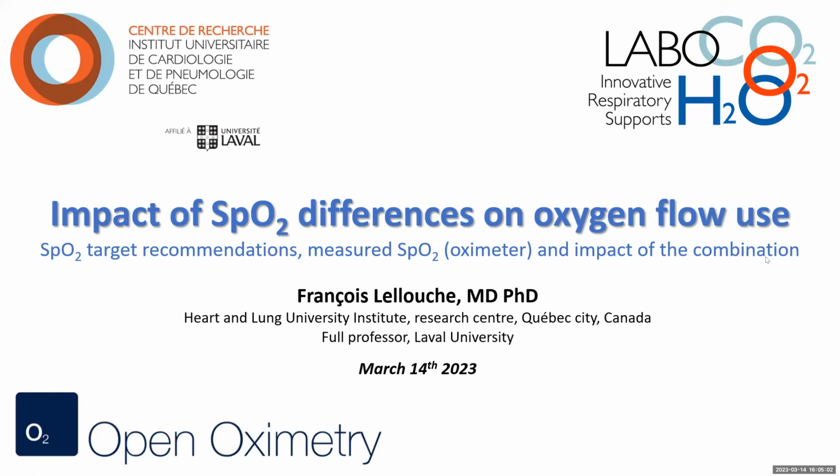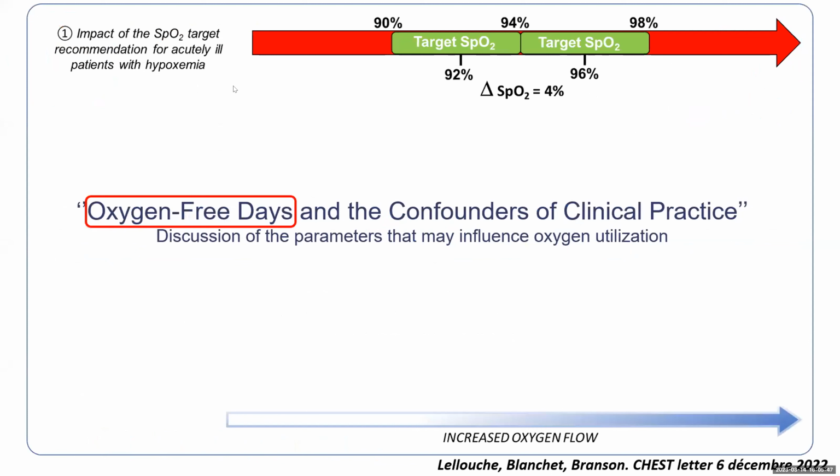Okay, thank you, Karen. Thank you, Michael, for the invitation to share our recent data on this issue. There was a question in the chat about the clinical relevance of this small difference, error, bias, discrepancy between oximeters. I will show you the impact on flow use related to this difference in SpO2 measurement, but also what is even more important, the impact of the discrepancy on SpO2 target recommendation. We will discuss there was a real difference in these recommendations.